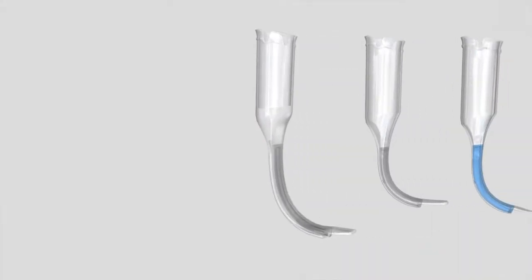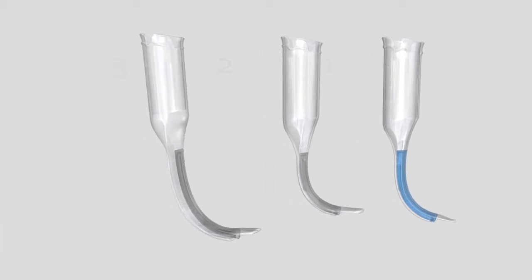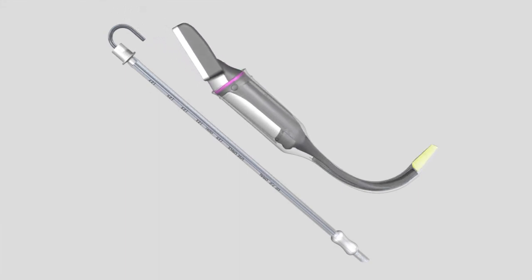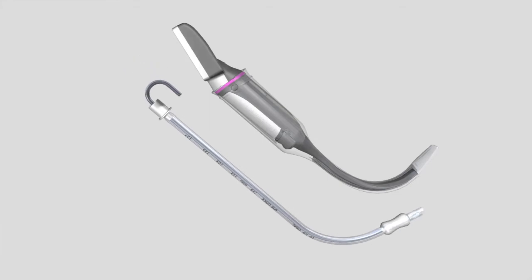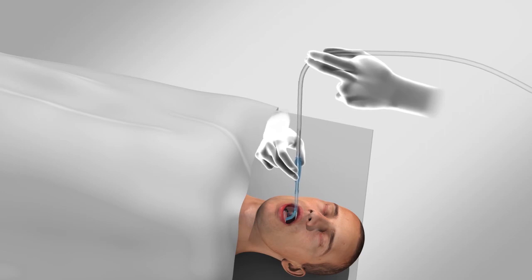The standard or non-channeled blades are used when integral guidance of the ET tube is not indicated. In this case, the assistance of a stylet will be necessary. Lubricate the distal tip of the standard blade using a water-soluble lubricant, taking care to avoid covering the distal window of the blade with lubricant. Lubricate the stylet and the ET tube. Preload the stylet into the tube and bend the tube to match the curve of the blade. Open the patient's mouth using the standard technique and suction any excess secretions in the airway.